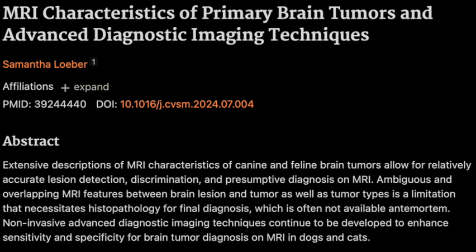So that's where MRI comes in, right? This amazing technology that lets vets actually see inside the brain. It's like magic. It's pretty close to magic. Magnetic resonance imaging, or MRI, is the gold standard for diagnosing brain tumors in dogs. It provides really detailed images of the brain so we can see the tumor itself, but also the size of it, the location, and some specific characteristics. There are other tools too, like cerebrospinal fluid analysis that can give us some information. But MRI is definitely the most accurate and comprehensive for this. So it's like the top dog of brain scans. You could say that.